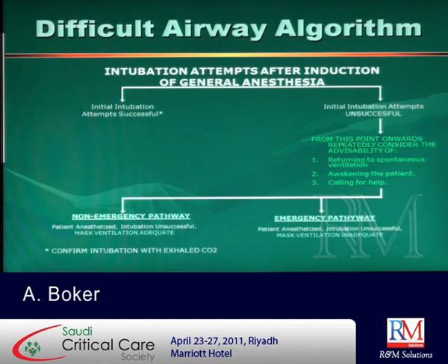So oxygenate, try to ventilate. If you try to ventilate and it did not work, what then? Call for help. LMA, laryngeal mask airway. Take a deep breath and think about what you do. Take a deep breath, and then hope the patient will take a deep breath. That's very important. You have to keep your head up. What else? Video assist?